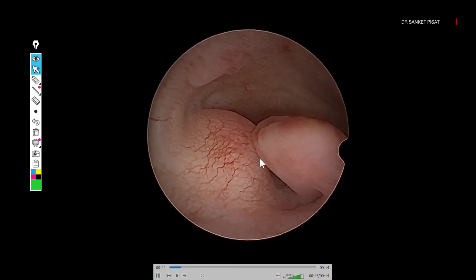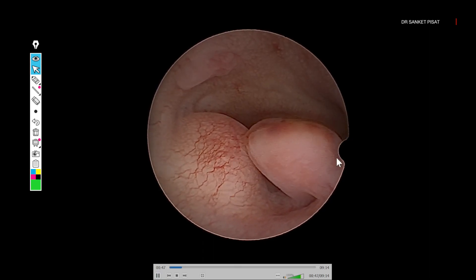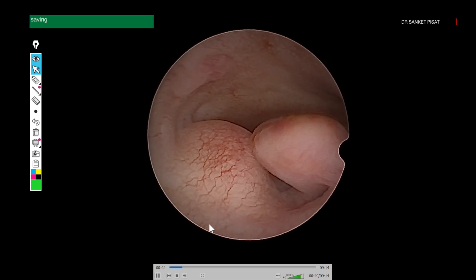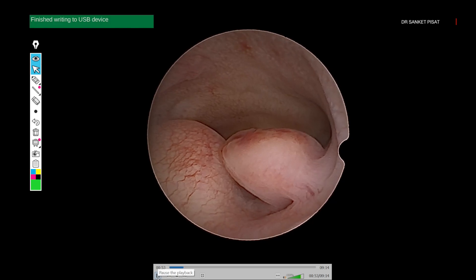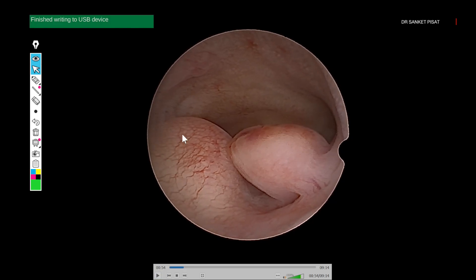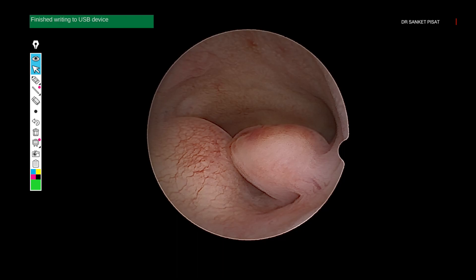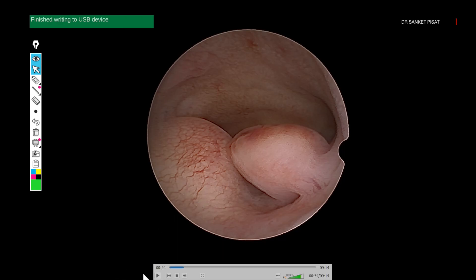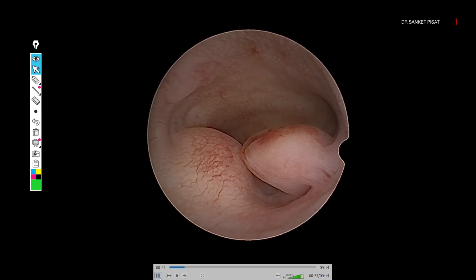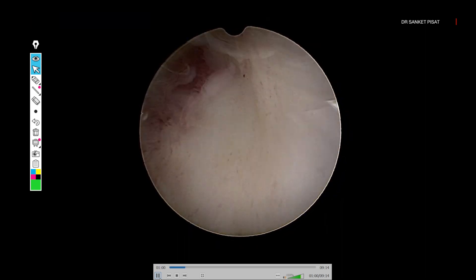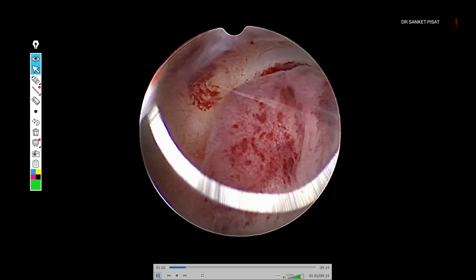You can see clearly there are two pathologies here — the submucous fibroid and a polyp. While doing the surgery, do not waste too much time at the diagnostic part. What you need to get is where the fibroid is originating from, what is the grade of the fibroid, how difficult it is going to be, and where is the base where you are going to make the final cut in order to detach the fibroid from its attachment. This is a completely unedited or very minimally edited video.